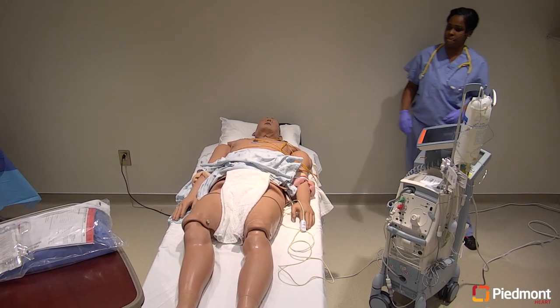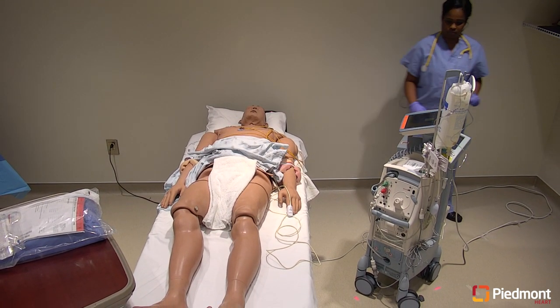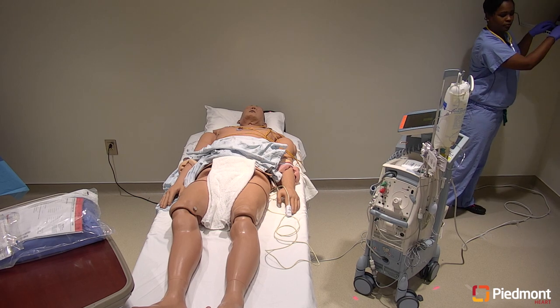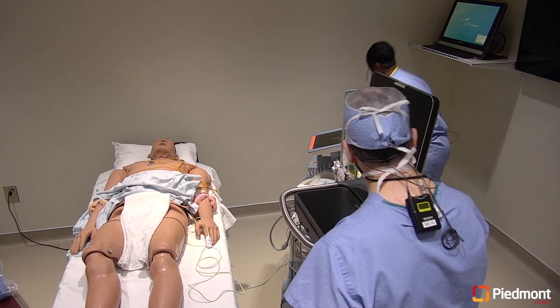For the purpose of this video, we will not discuss sedation or medicating for pain, but please make sure you are properly assessing your patient's needs prior to the time of insertion. Assist in setting up the ultrasound opposite the provider.